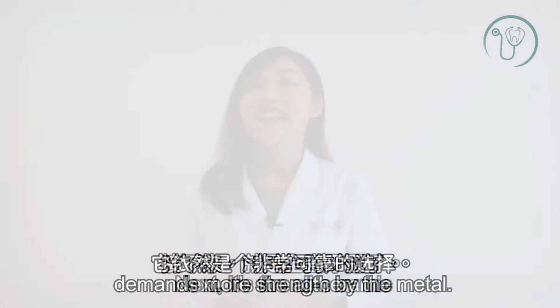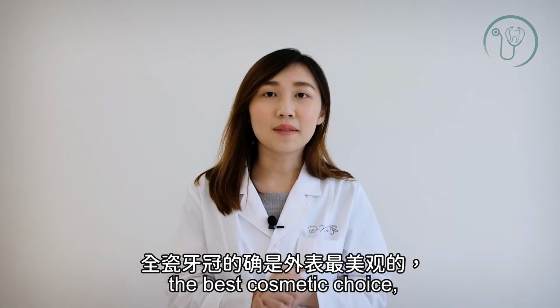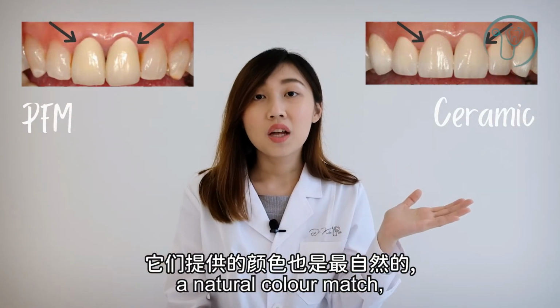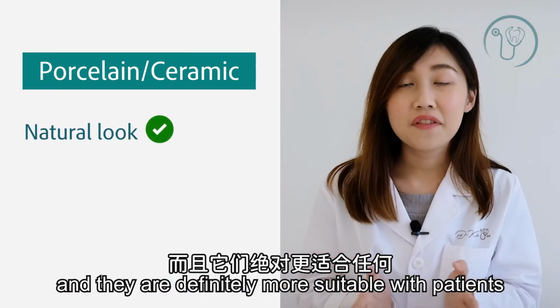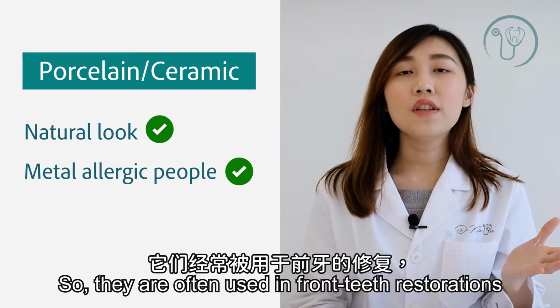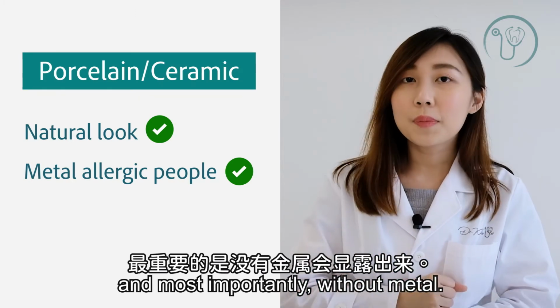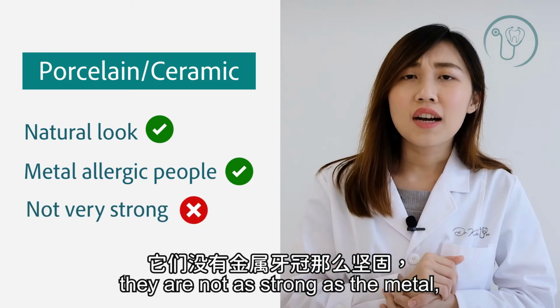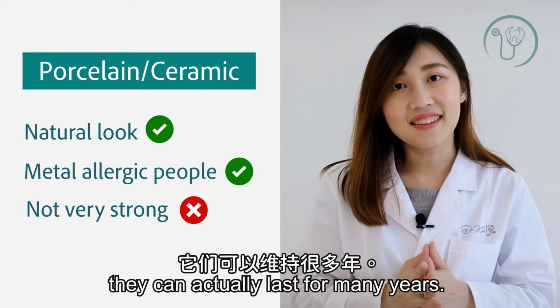However, this is still a solid option for your front or back teeth, or when a dental bridge demands more strength from the metal. Next is an all ceramic or all porcelain crown. They are easily considered the best cosmetic choice because this dental crown provides a natural color match that is far better than any of the other materials. They are also more suitable for patients who have metal allergies. They are often used in front teeth restorations because they give the most natural look, and most importantly, without metal. The biggest drawback for this crown is that they are not as strong as the metals, but if you maintain them properly, they can last for many years.